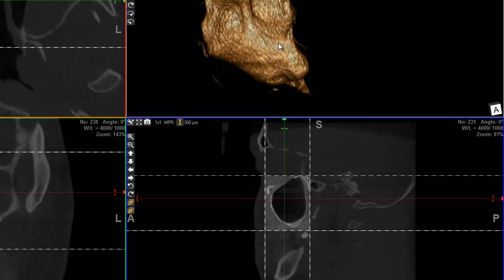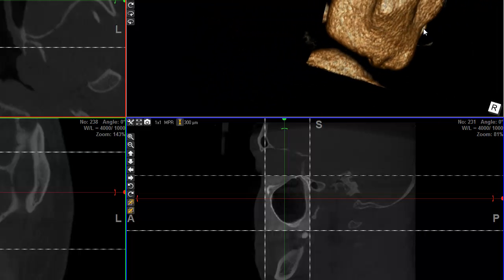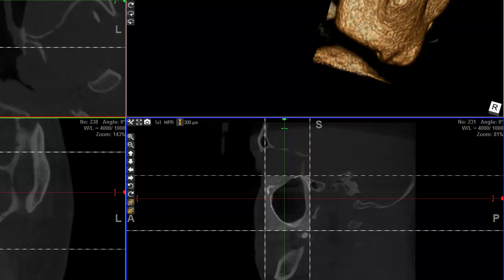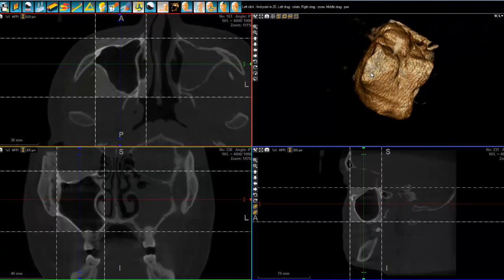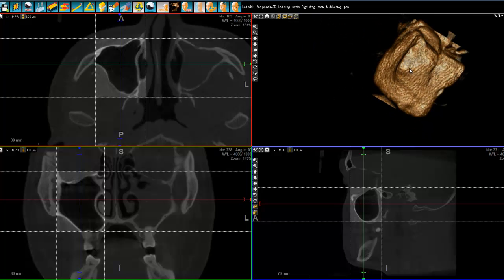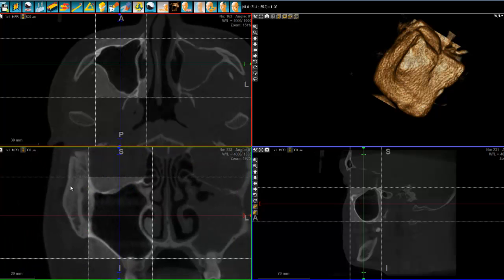There we get our Sinus. I could calculate the volume now, but at this point it wouldn't give me any good information, because I would get the volume of the full Sinus — which is not the target. We want the volume of the biomaterial. So let's define a level where we're going to place the biomaterial. At this intersection here, it is going to be more or less the level.